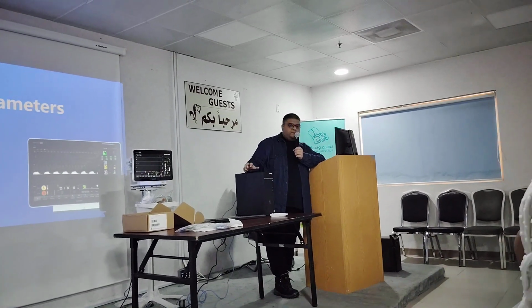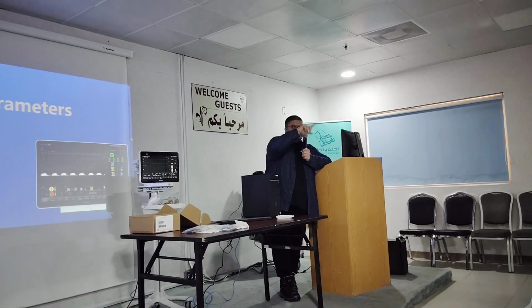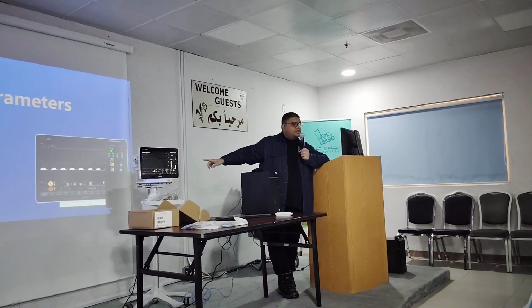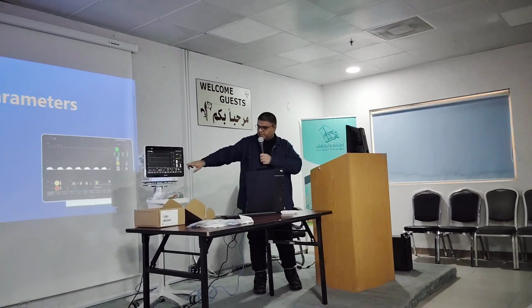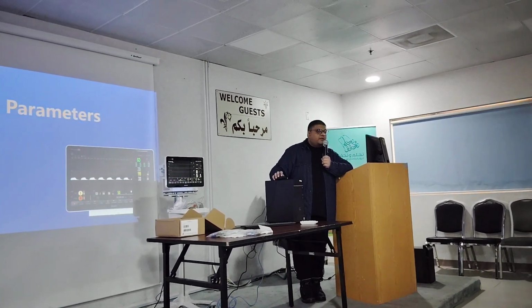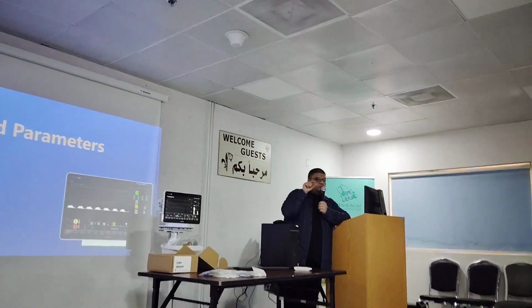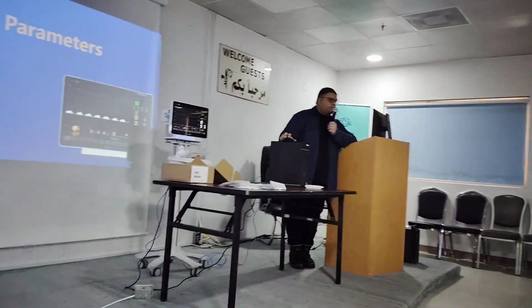If you want, I can help you understand. Because you're using a small screen. Yeah, it's using a small screen. Because as you can see, there's the size of the words. Even if you get a bigger monitor, it won't change. It will increase the space on the monitor, but these numbers that you see are always the same size. It's because this is a regulation. By regulation, we cannot change the size of the numbers. So if you use a small screen with the CMS, the numbers you see on the screen will be less. But if you use a larger screen, the bigger you use, the more numbers you see.